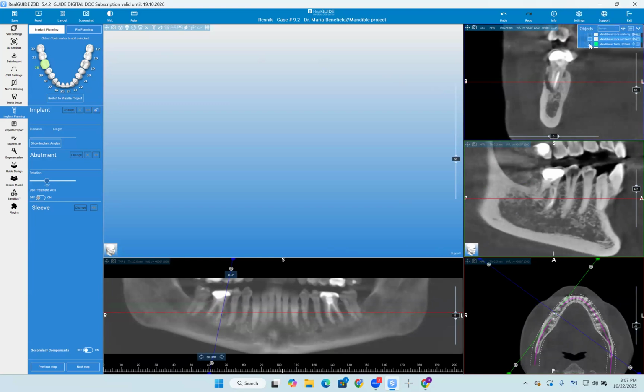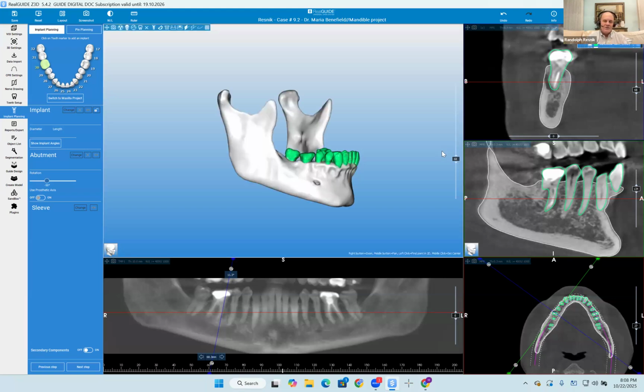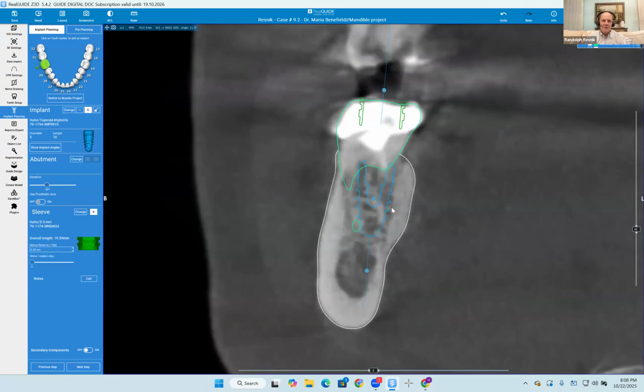That makes sense. So you looked at a 5 by 10. I play around with the software for the future. Once we heal, then we'll decide. You're almost likely to have a 5 by 10. Possibly the worst scenario would be a 5 by 8, but I think you'll get a 5 by 10 in there, no problem, after healing. Yeah, because he even gave you a little bit of buffer there apically. So yeah, you're good.